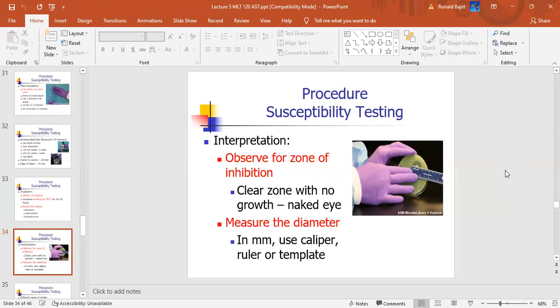What I like to do when measuring the zone size is have the end of the ruler be here and measure from 1 to 3. He's measuring from 0 to 2 or whatever. I don't like to use the end of the ruler for this end. I like to extend it out a little bit and start at 1 or 2. You see my preference?